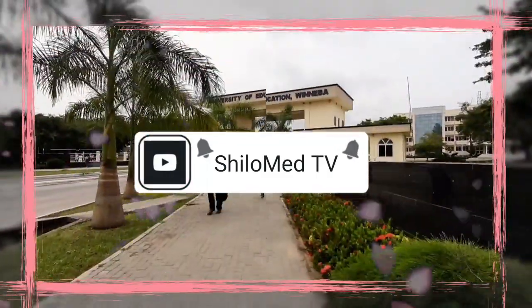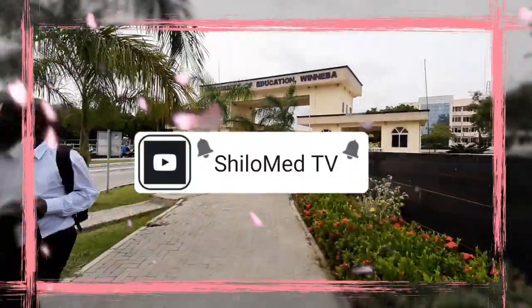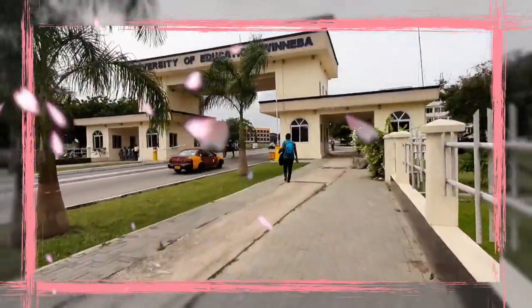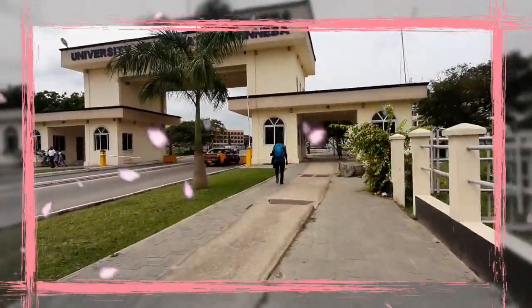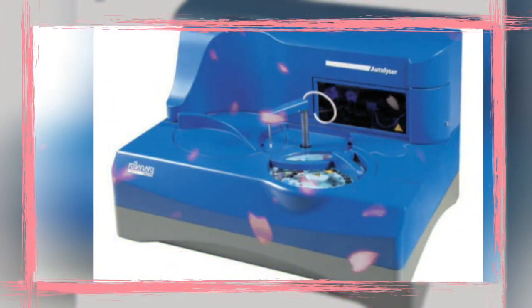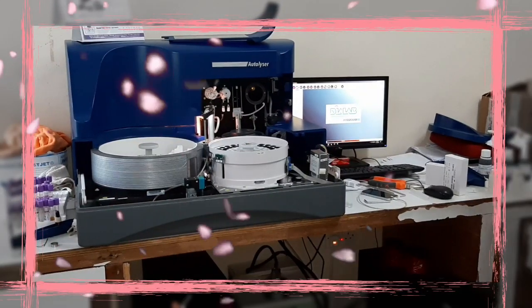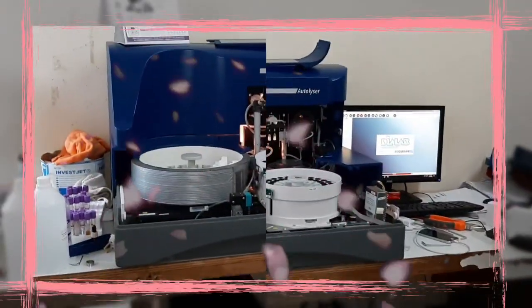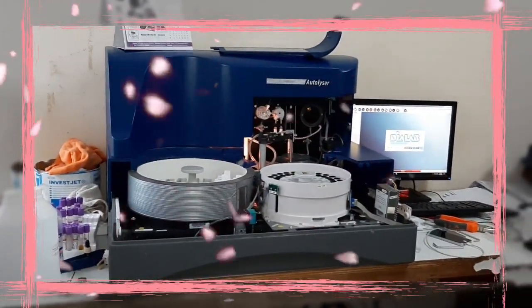After a very long, tiring journey, we finally arrived at the University of Education, Winneba, and headed straight to the university clinic where we had to restore their DIALAB Autolyser as found in those screens. This machine had been around for almost about 2 years without working because their engineer wasn't able to restore it back to action after it had a problem.